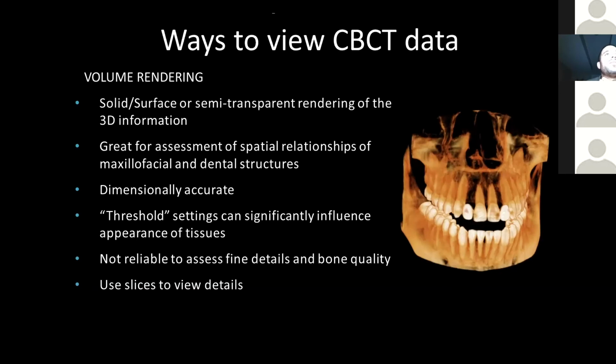What software are you using in this presentation? Most of the radiographic images were from a software called Anatomage, which is by a company, sorry, the company is Anatomage and the software is called In Vivo Dental. If you have an iCat unit that you've bought in recent years, it's going to come with TX Studio or Treatment Studio, based on how you pronounce it. And it's going to look just like this. And really what iCat did, or Imaging Sciences did, is contract with Anatomage to use their software guts with the iCat name on it, basically.